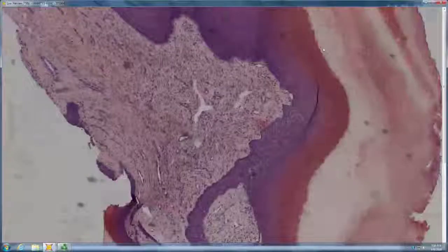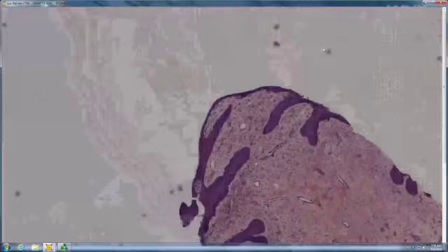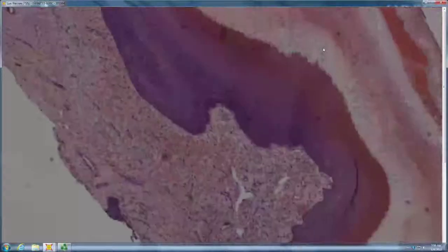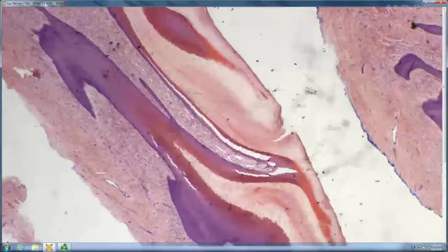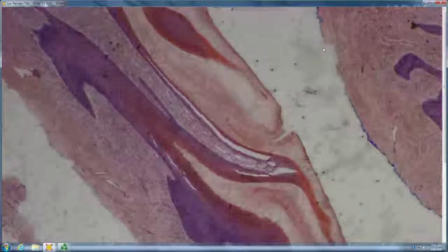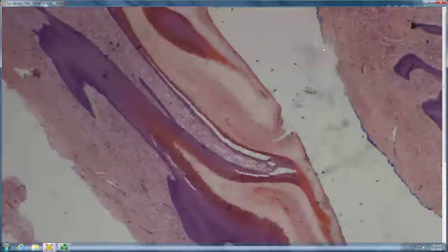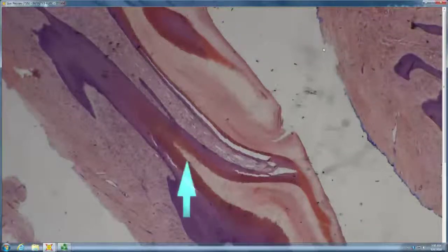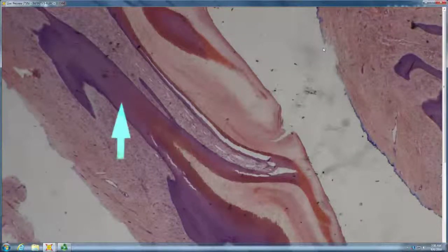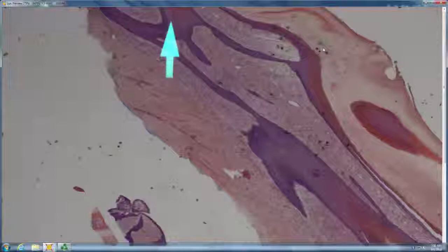David, so tell me about this oma. This has that pilomatrical differentiation, maybe. How about a verrucous cyst? Sometimes they have that. So, what if we were looking for red V's. So that looks almost like a proximal nail fold right there, and then you got another one right here, and sort of another minor one there. And here. Onychomatricoma?